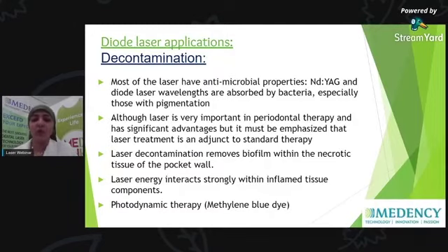For example, we want to decrease the percentage of bacterial infection in our case. And also if you are doing any surgery, we don't want swelling to happen. We don't want the gingiva to be inflamed, for example. So all of these we can do using the diode laser device. First of all, the decontamination.